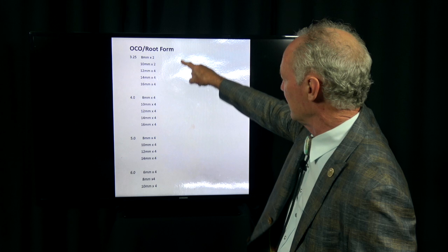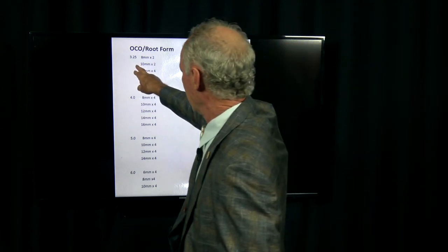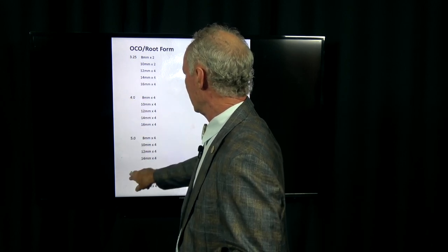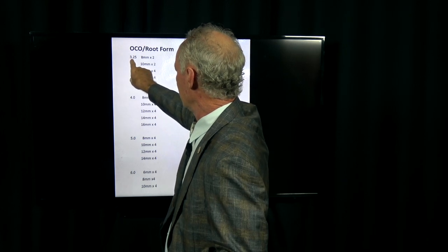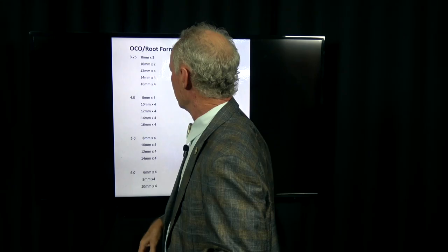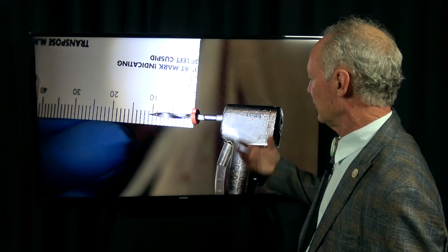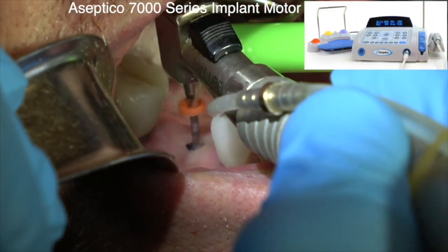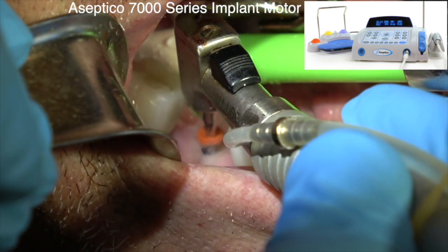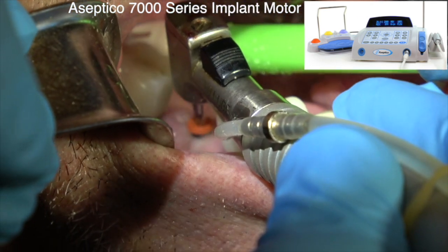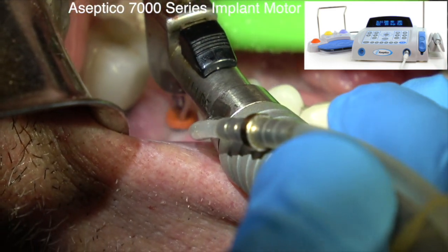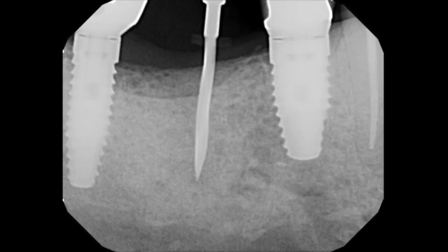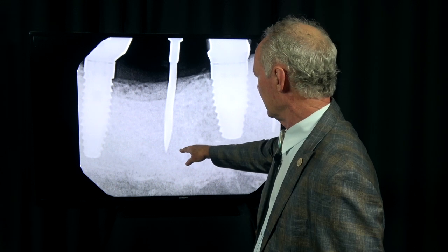These are the different implants being used: 3.25, 4.0, 5.0, and 6.0. With each of these implant sizes, the drill is going to be a little bit smaller in diameter than the implant. In this case, we felt like we had 12 millimeters, so I'm going to drill my pilot hole through the tissue staying parallel to the bicuspid tooth, mesial to the implant to be placed. This is the PA of the pilot drill in the osteotomy.